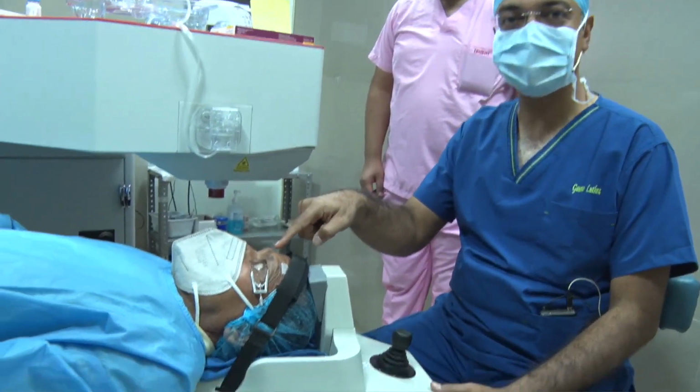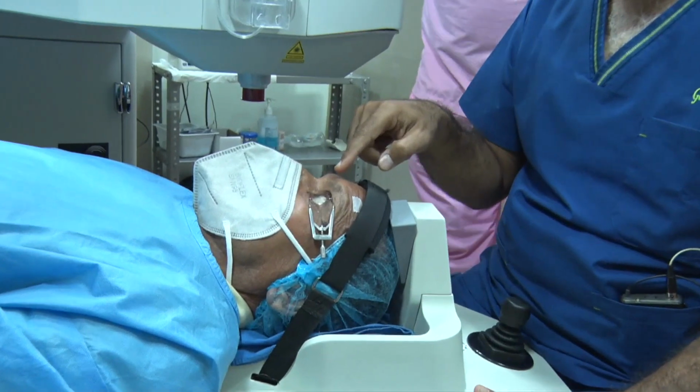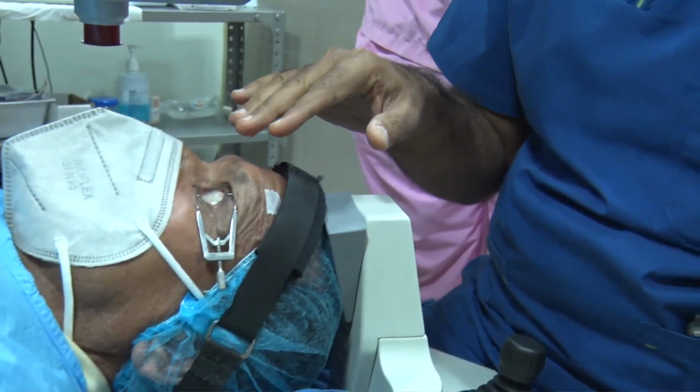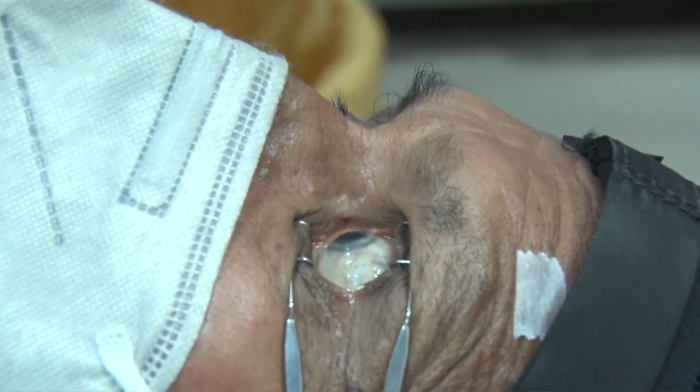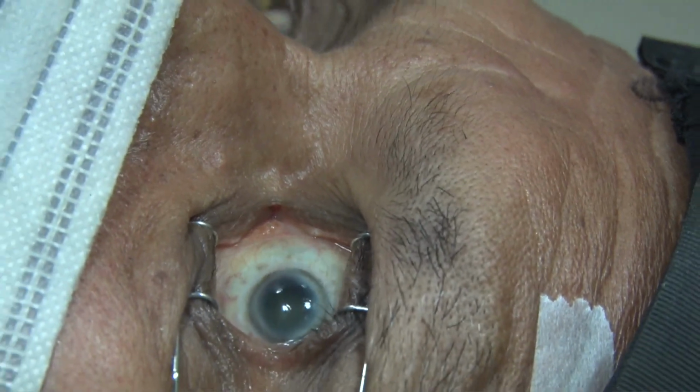First, what we'll do is we'll show you the patient's eye. It's a very deep set eye, and I've just put a speculum. Normally, I don't put a speculum, but it's a very deep set eye with a dense arcus also. Not an ideal eye for anything related to cataract surgery. All the same, now I'll show you the parameters.